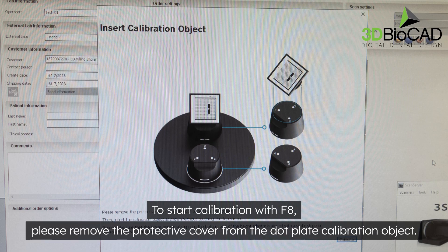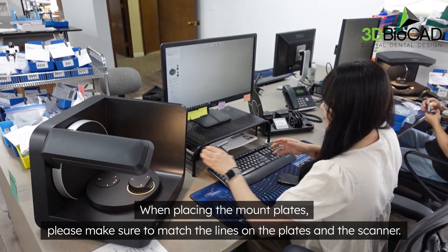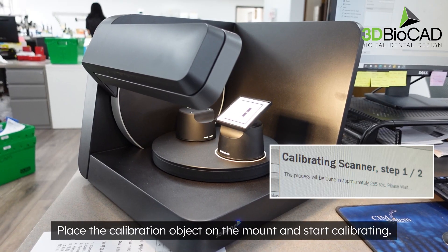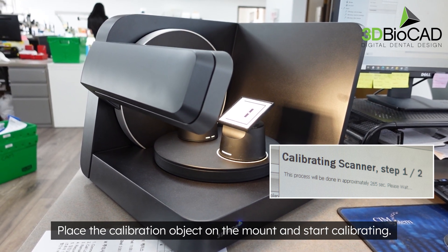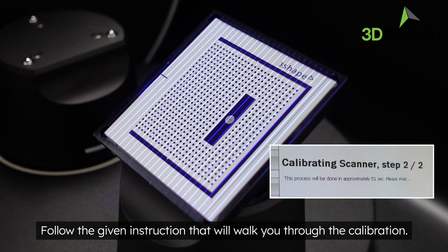To start calibration with the F8, please remove the protective cover from the dot plate calibration object. When placing the mount plates, make sure to match the lines on the plates and the scanner. Place the calibration object on the mount and start calibrating, following the given instructions that will walk you through the process.